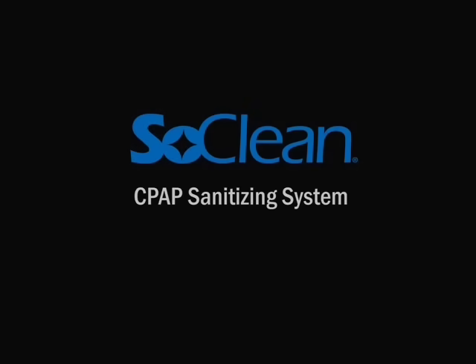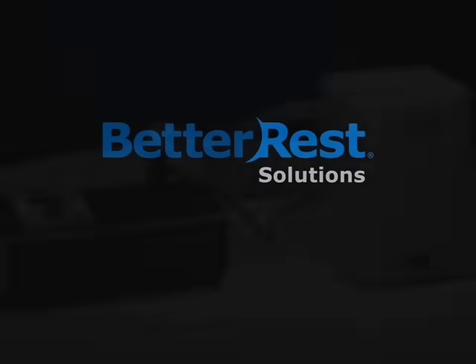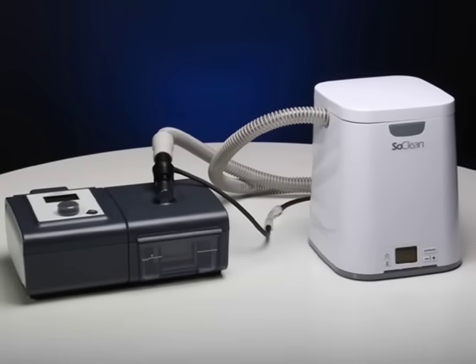Thank you for choosing the SoClean CPAP Sanitizer from Better Rest Solutions. After a few simple steps, you'll find that daily sanitizing of your CPAP equipment has never been easier.